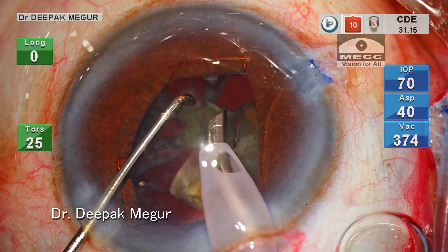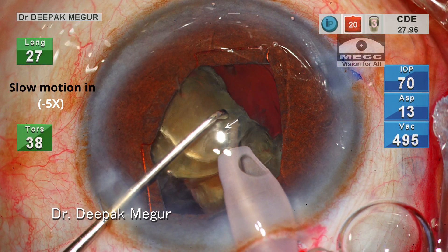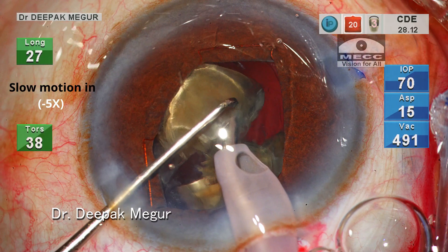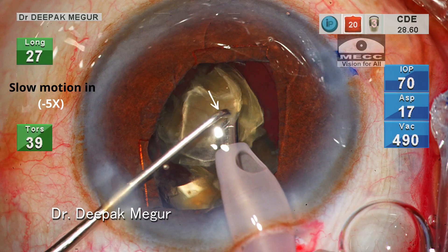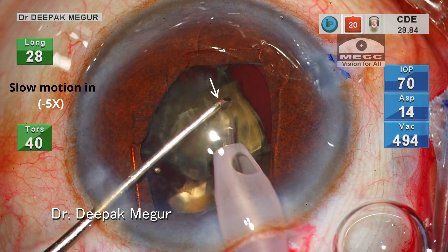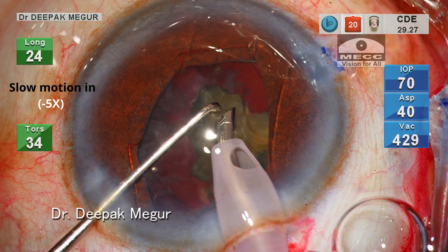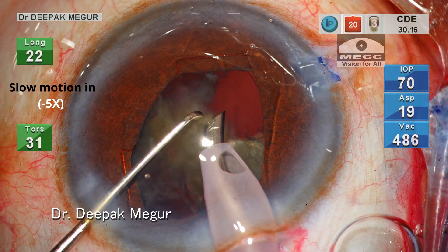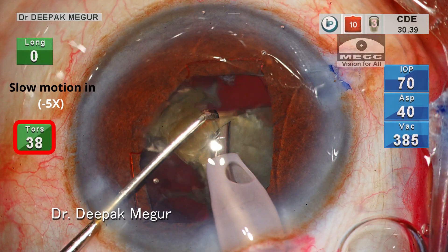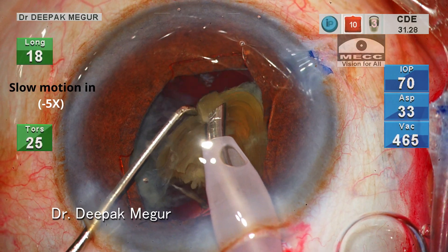Now let us observe the emulsification of this fragment in the slow motion clip. I am holding the tip in the center with the bevel turned to one side. One can see that the fragment being emulsified is below the pupillary plane. The chopper is held just above the phaco tip, acting like a guard preventing any small lens particle from flying anteriorly and hitting the cornea. The key is to control the energy delivery so that it's never too much for the fragment to burst open into small multiple fragments which can then fly around uncontrolled.